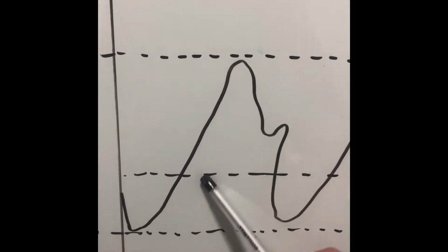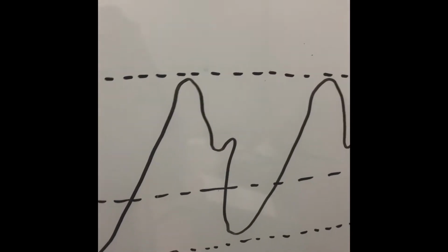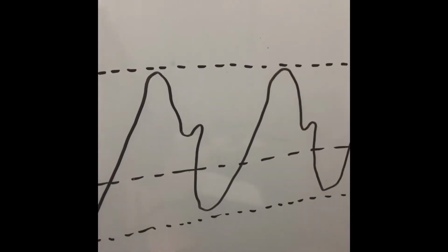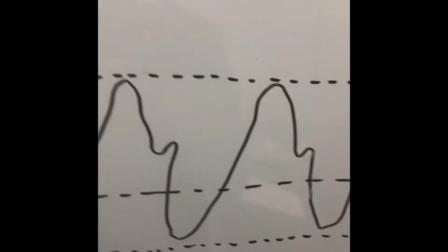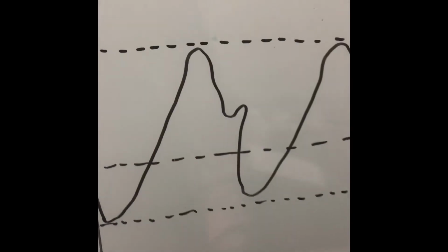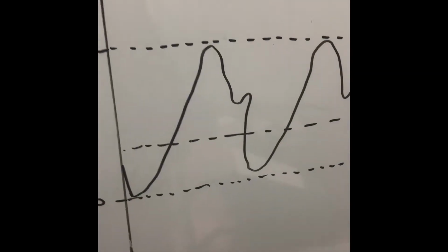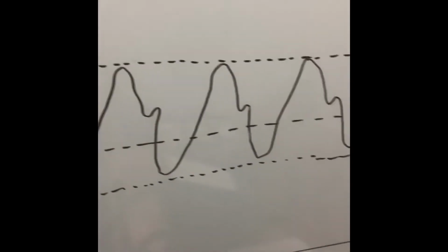As we can see here, same thing, a very slack systolic upstroke. So contractility of the heart is poor, maybe because the preload is not quite there. The heart is not stretching out and contracting efficiently. The diastolic runoff is also near vertical. So this is because there is less resistance and vasodilation. So we might be seeing this in a septic patient or a patient with anaphylaxis, a distributive shock type of patient.